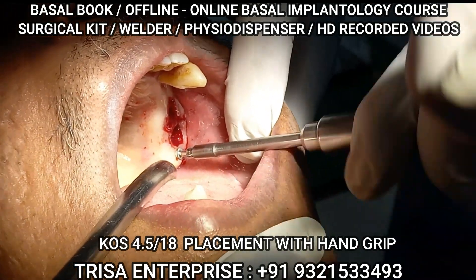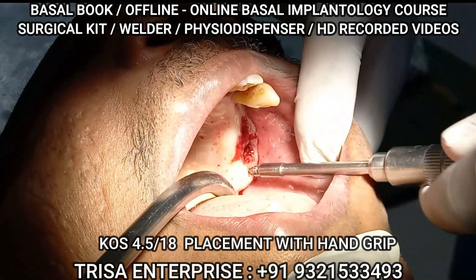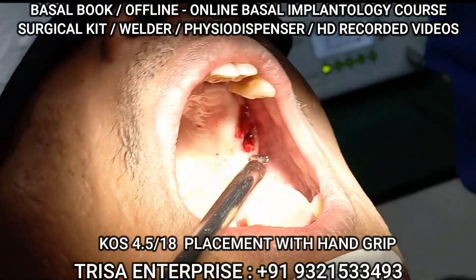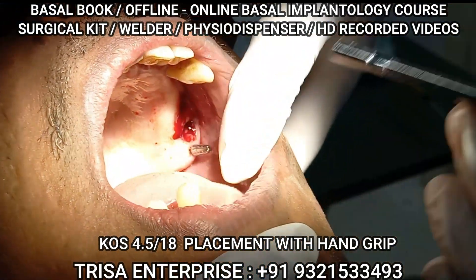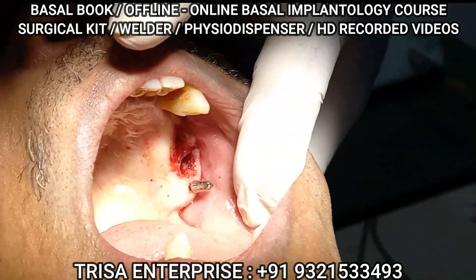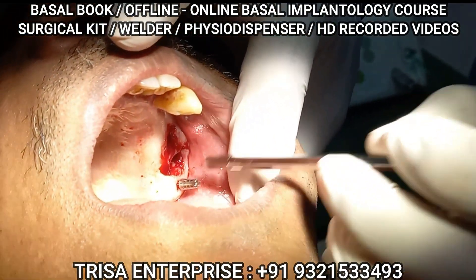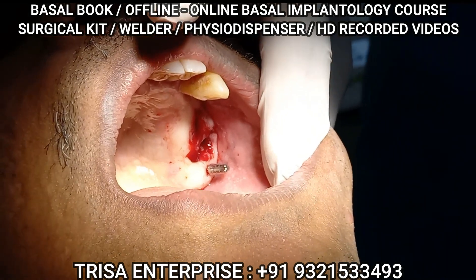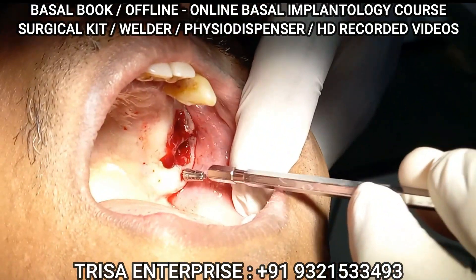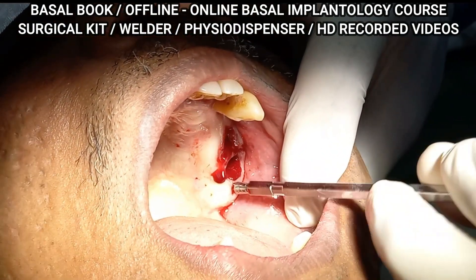I'm getting very good torque — I'll show you with the ratchet also, don't worry. Now I will demonstrate: apart from the insertion torque, if I tap on it — can you hear this? Just put your finger here. Can you hear this noise? It's a very sharp note, which indicates good osseointegration.